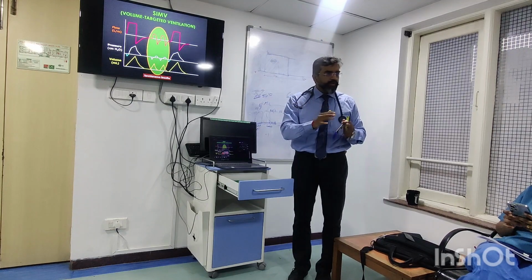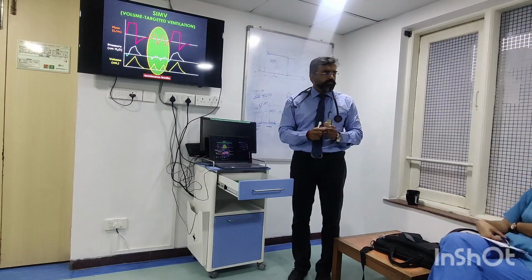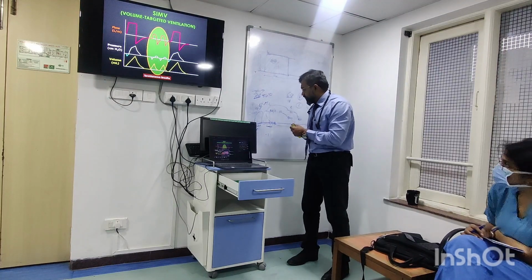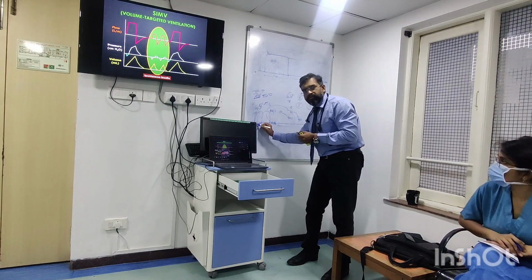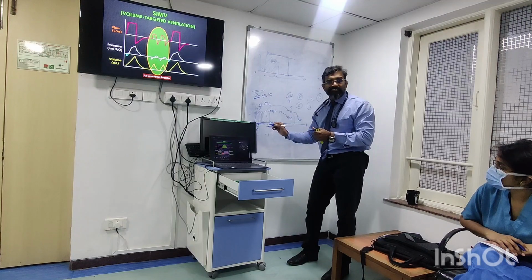Whereas in SIMV, what is going to happen? You take a breath, stop, he takes a breath, it allows him to take breathing, but it doesn't assist, because it is not in the SIMV period. But if he is in the SIMV period here, and he takes one breath, then takes one more breath, one more breath will come here. Yes, that time it will deliver.